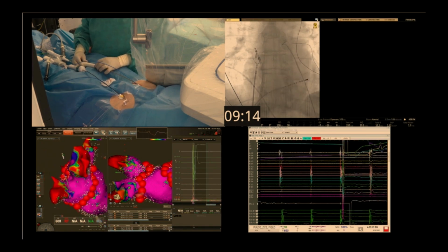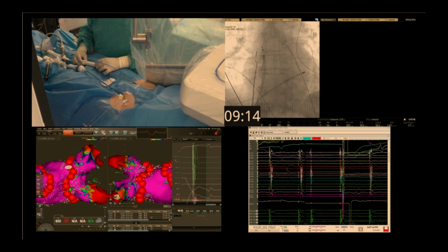Yeah. And honestly, this is still a clunky sort of workflow. Once it's fully integrated, you can imagine this routinely taking 5 to 7 minutes to isolate the veins. And of course, the flexibility of point-by-point ablation is that you can then potentially target other things like a CTI, or let's say some of these AF source mapping algorithms really become accepted and reliable. Then we could start using this technology to target those regions. And atypical flutters and ATs and line-based ablation.